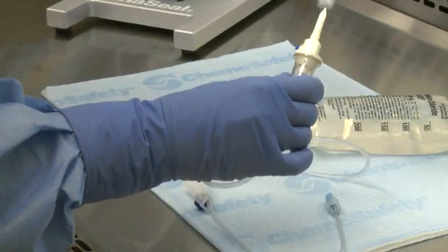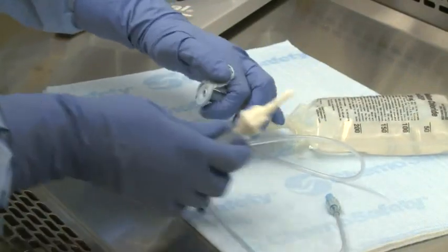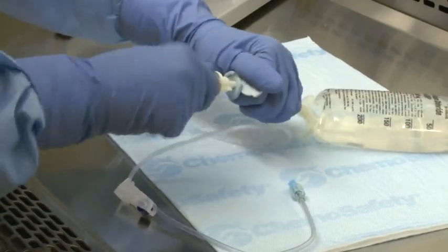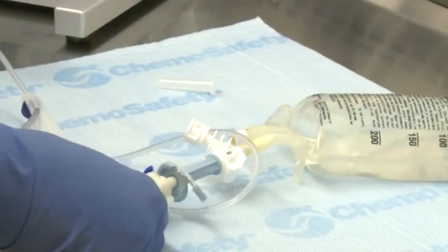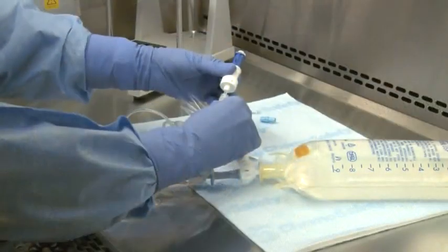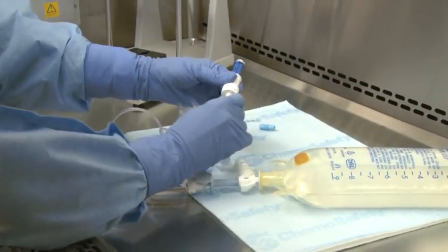If the IV line is being primed in the preparation area, open the blue cap on the distal end of the infusion adapter and spike the administration set into the infusion adapter. Then prime the line according to the manufacturer's instructions or your facility's policies and procedures. If required by facility protocol, luer lock an injector to the end of the IV administration set.